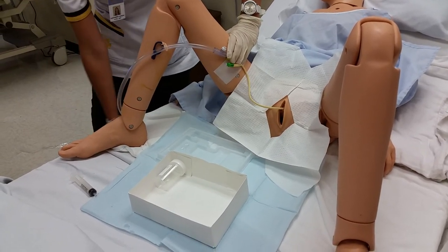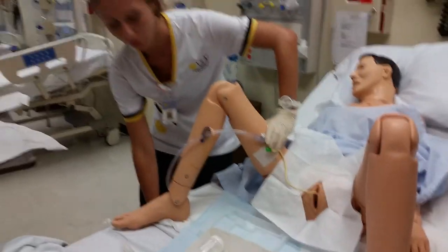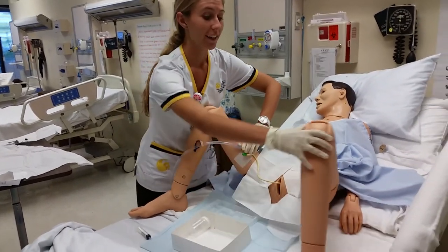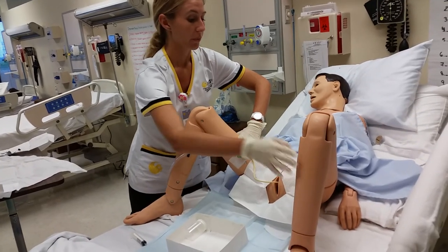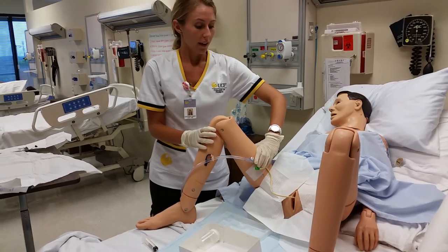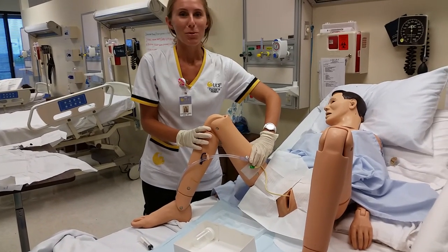And then we're going to go ahead and place the bag on the side of the bed that is not the side rail. We want to put it on a part of the bed that doesn't move. And I would document the procedure, document how the patient handled the procedure. And then from there on out, I'd assess intake and output, and we have a happy patient.